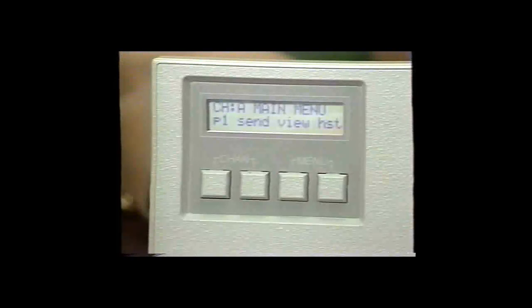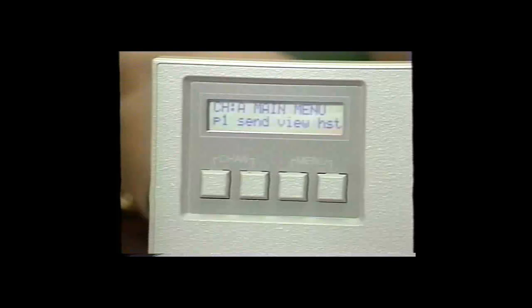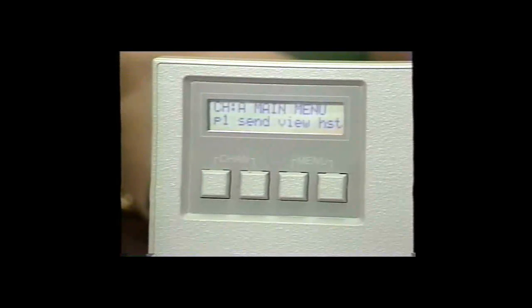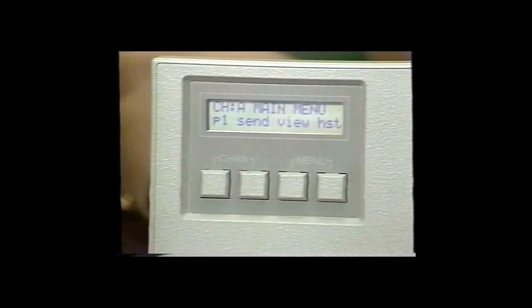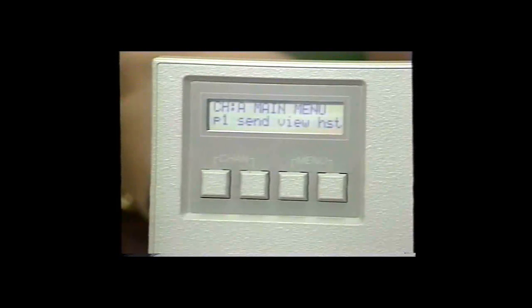Once the 381 is powered up, the main menu will be displayed. The main menu is contained in two pages. Page one contains the functions that are most often used on a routine basis: Send, View, and History.